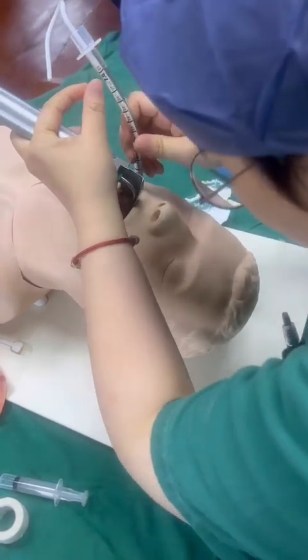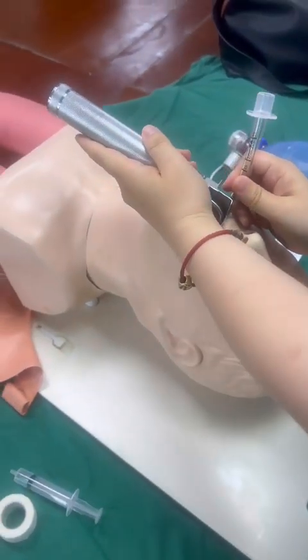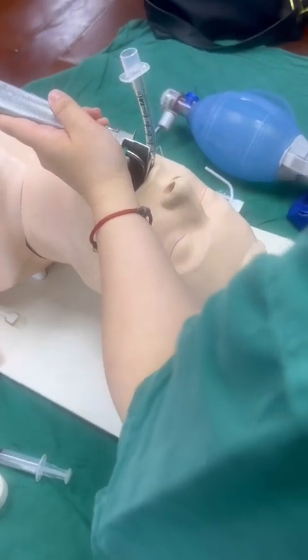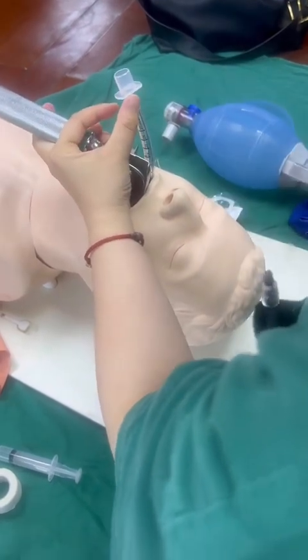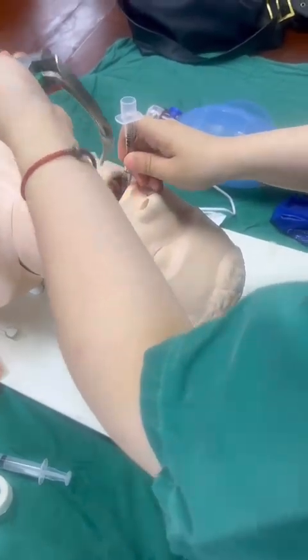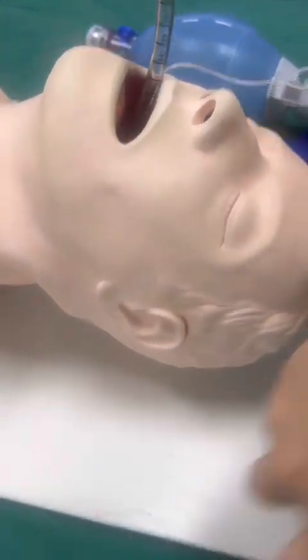Ask the assistant to remove it. If no assistant, you can ask the teacher to help you. To remove the stylet, at the same time you insert the tube, and remove the laryngoscope. Check the position from here.